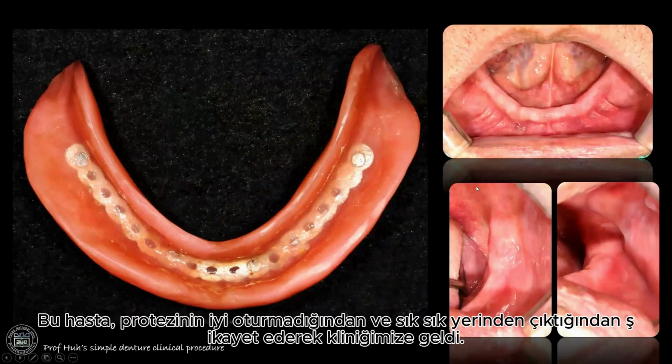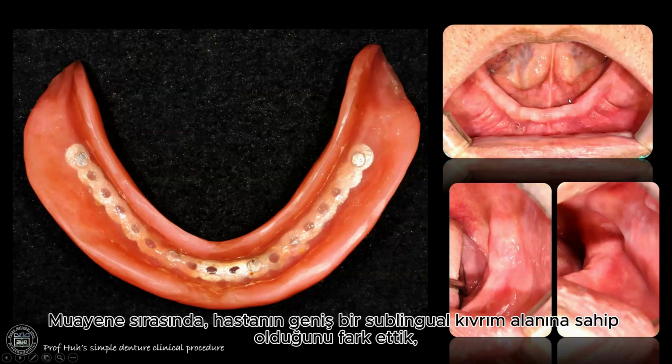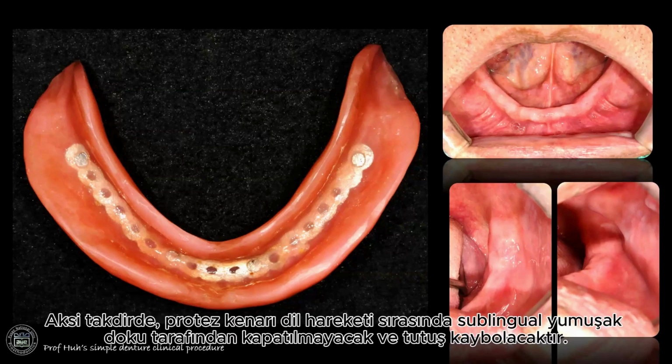This patient came to our clinic complaining that his denture was not fitting well and often dislodged. So I decided to perform a chairside direct relining procedure. During examination, we noticed that the patient had a broad sublingual fold area, and when opening the mouth, the tongue tended to retract posteriorly. In such cases, it's crucial to form the sublingual area thicker with intention, okay?